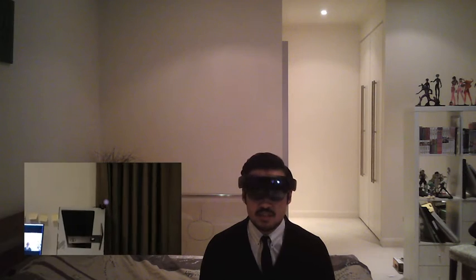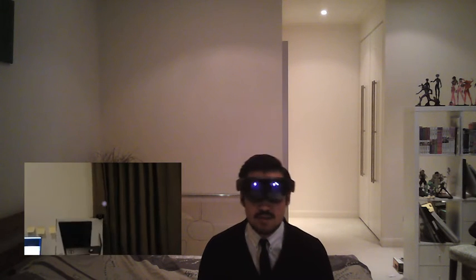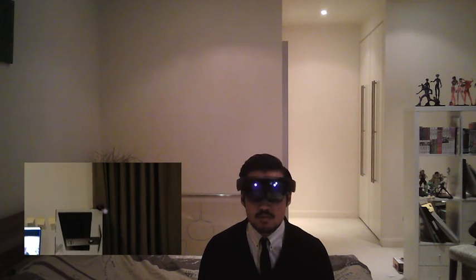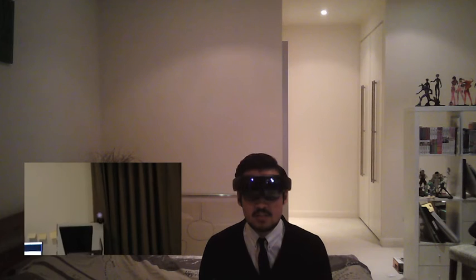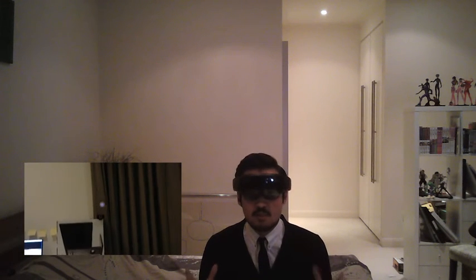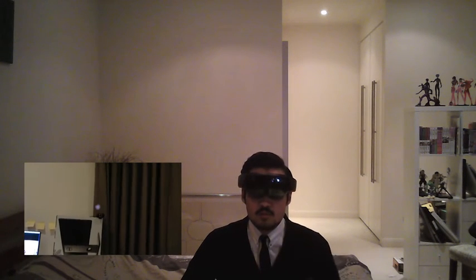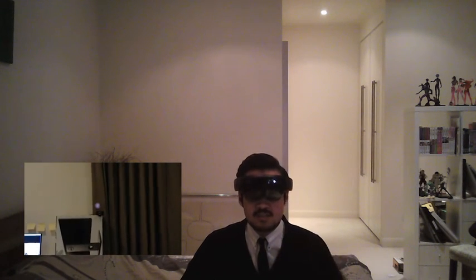I work on the UCL Peach project, and here on my head is Microsoft HoloLens, which is an augmented reality headset from Microsoft. I'm about to show you a prototype of the application I'll be working on with my team, and in essence it's an augmented reality model viewer aimed at medical specialists. And the particular model we'll be looking at today is a model of kidneys, so let's begin.